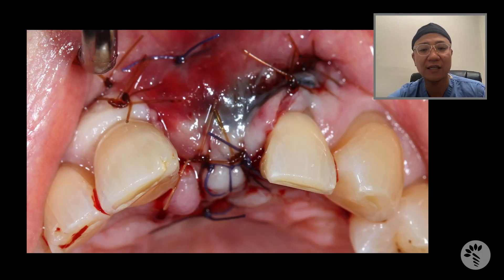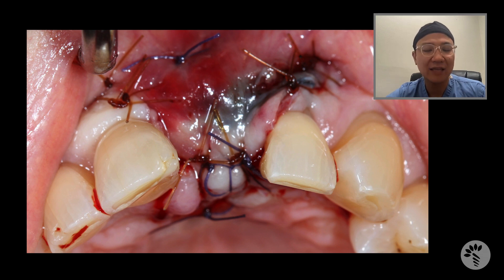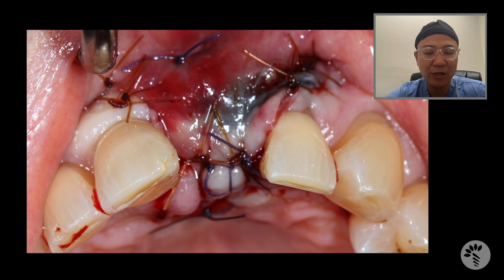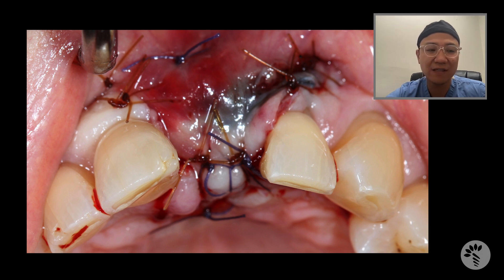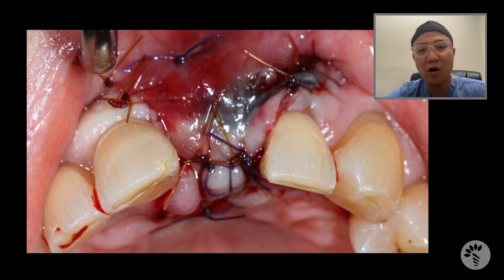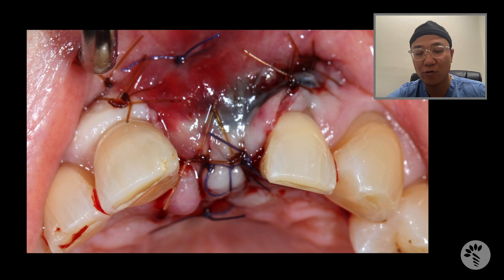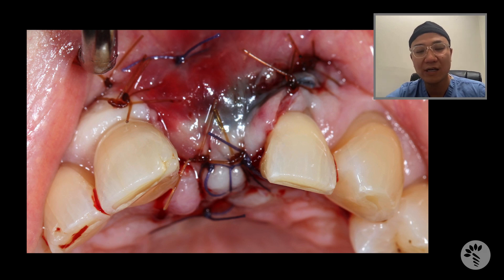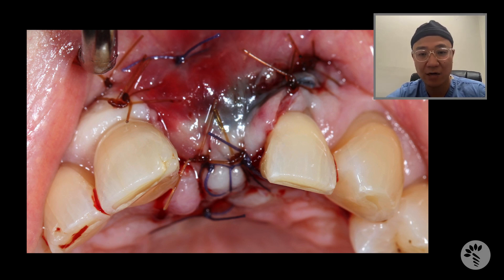You can clearly see that primary closure was obtained, and in cases like this, achieving primary closure is the key. When you have this much larger augmentation, if you leave this membrane or bone graft exposed, there's a much greater chance for contamination by saliva, plaque, bacteria, and food debris.